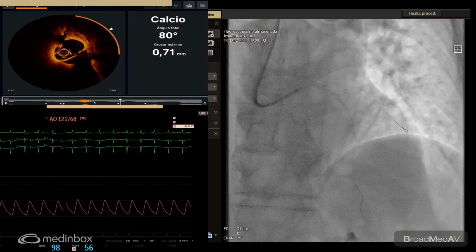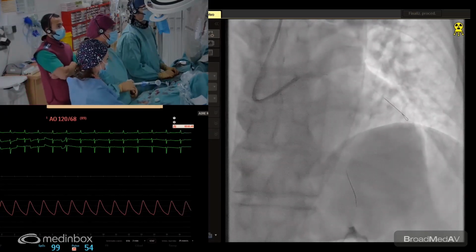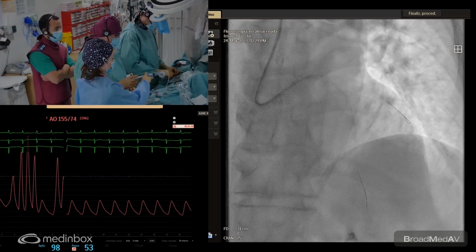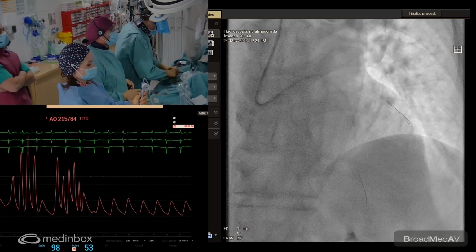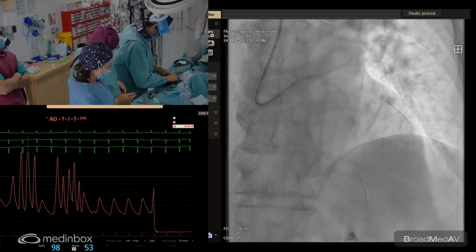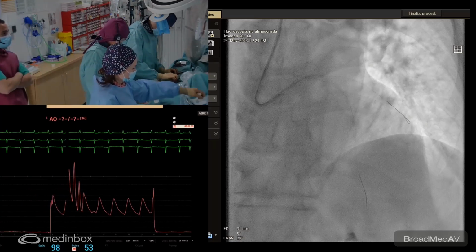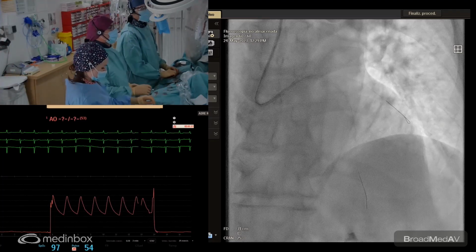And now this drug-eluting balloon approach is moving from the small vessels and side branches and restenosis to all the settings, and we are using it more and more. You have to be comfortable with these dissections that are not flow limiting, but for sure the immediate result is more beautiful with a stent, but the possibility of not leaving anything there in the vessel is very good.